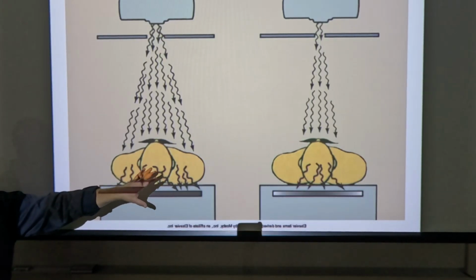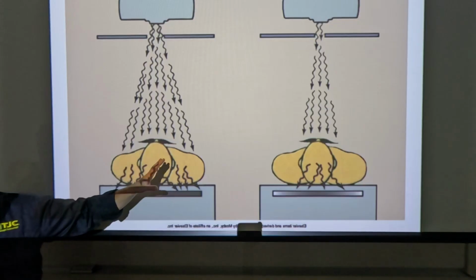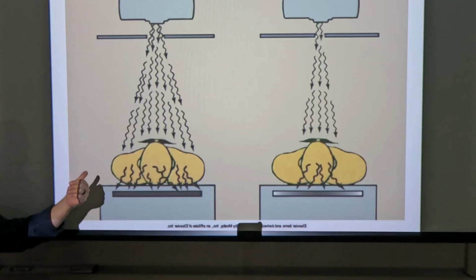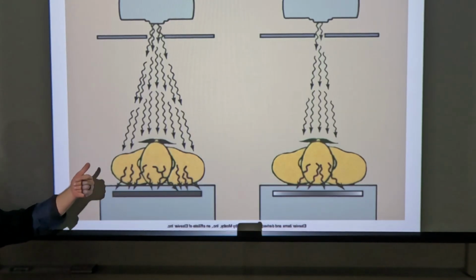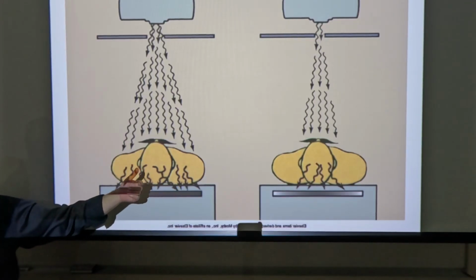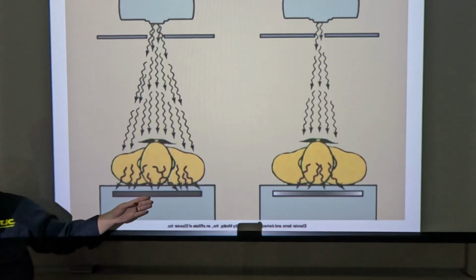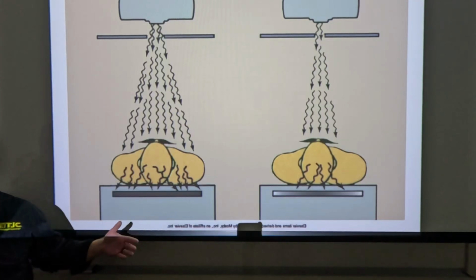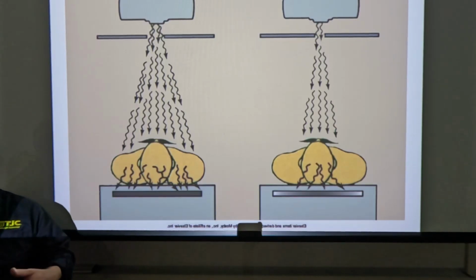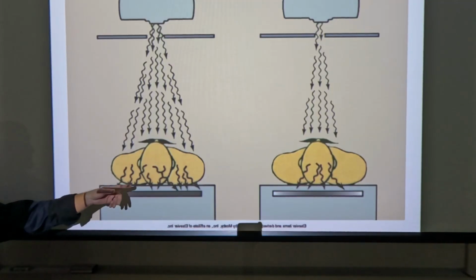You're not gonna go to a radiologist and say you're doing it, you're an idiot for doing it. No. In a trauma situation, the chest x-ray, I've talked about the golden hour before, right? Okay. So golden hour, every image that you take in the ER, providing you're taking any x-rays in the ER, takes up some of that golden hour, okay? So chest x-ray, then you collimate in, you shoot an AP T-spine, then you open your collimation, you shoot a KUB, then you collimate down, you shoot an AP L-spine, and then you do all your, you see where I'm going with this, right? You're wasting time. So in a trauma situation, chest x-ray becomes a T-spine.